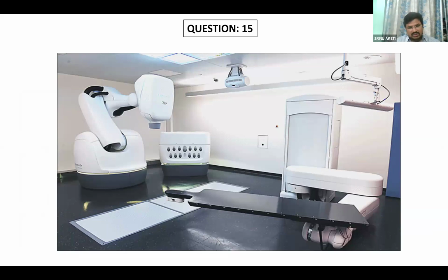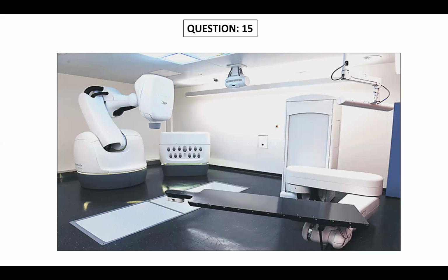Okay. So can you say something? What linac does it have inside? How will it treat? Sir, it has the 6MV linac energy beam itself, sir. Very good. It is treating with X-rays itself, like a 6MV low energy linac, like our conventional linac, but the collimator is very, very small. And there are different beam cones also. You can see the cones. Very good.